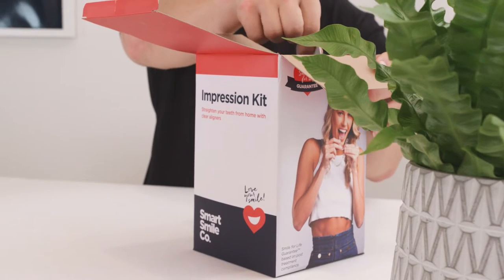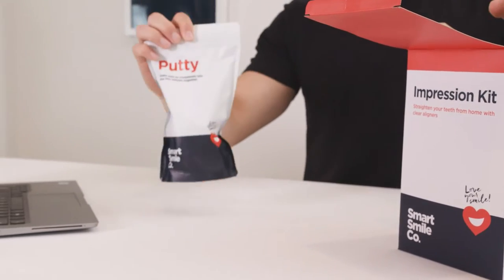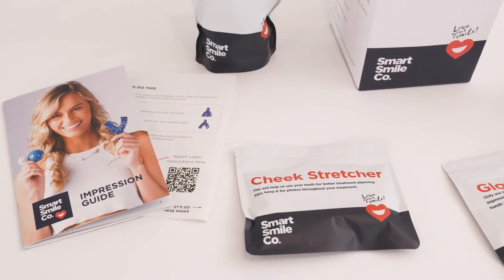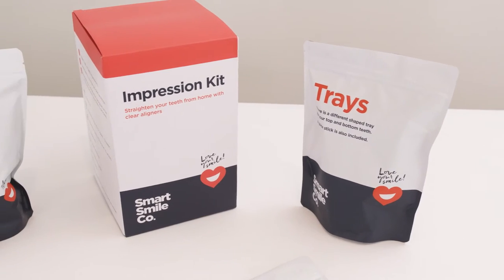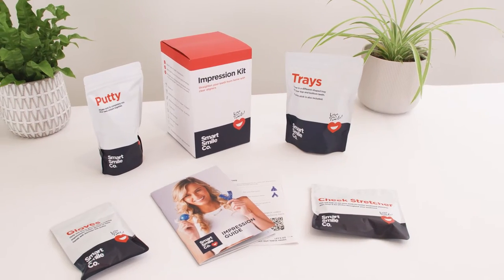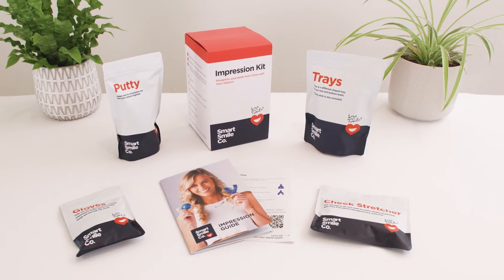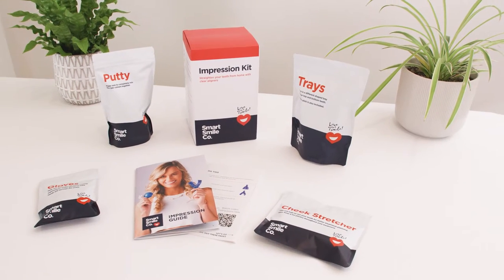To create your treatment plan, your SmartSmile Co-Orthodontist requires impressions of your teeth. If you have ordered an impression kit rather than visiting a clinic, you need to take six impressions. This video is a real-time walkthrough of taking an impression and is helpful to play while taking your own. A timer is included and provides instructions in real-time to help you take perfect impressions.